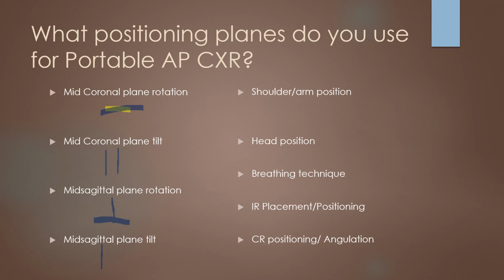Shoulder and arm position. Just because you're doing a portable doesn't mean that you can't practice good shoulder and arm position. You want to make sure that you're rolling those patient shoulders forward. So we're going to roll here.